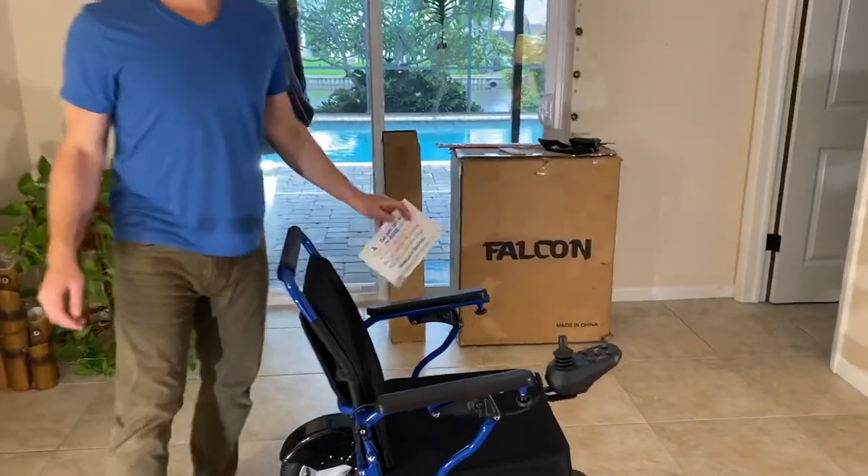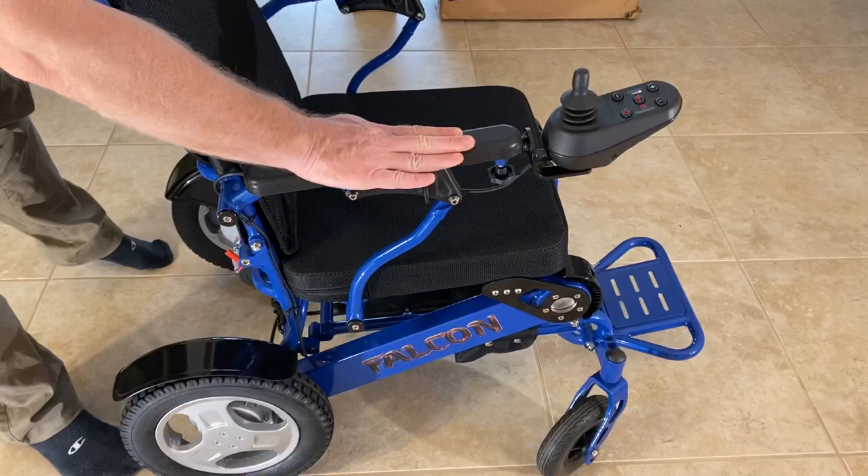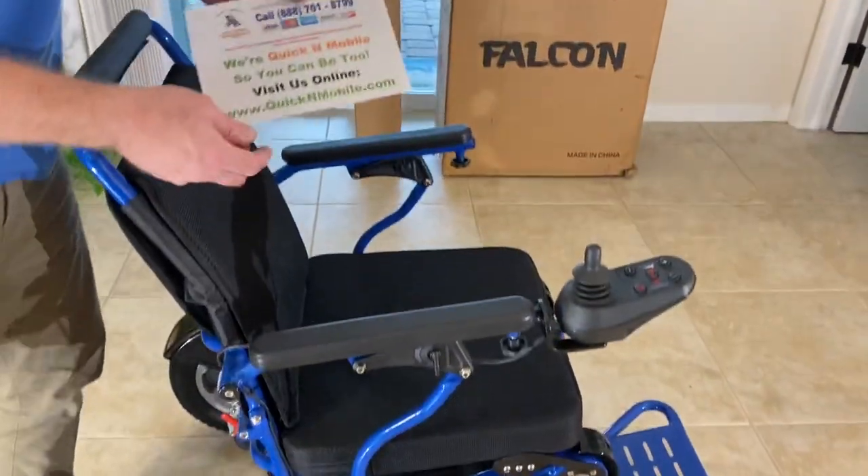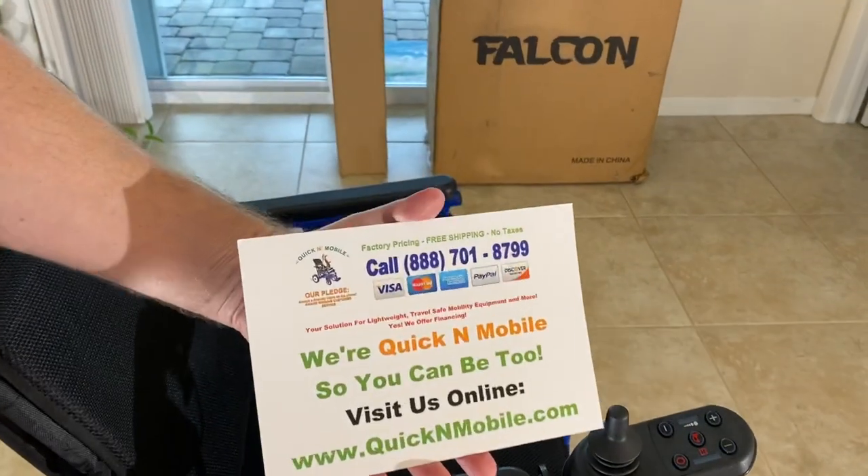Hello, this is Paul from QuickNMobile.com. We're going to do a video about the arm rests and how they operate on the Falcon reclinable power folding wheelchair.